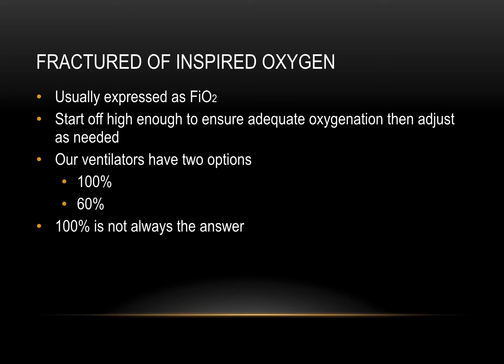So with such limited amounts of what we can vary the FiO2 at, we're going to choose the lowest, safest option for the patient to keep them oxygenated. Just so you know, though, ventilators, when we go into transfers, ICUs, skilled nursing facilities, ventilator care adult homes, they're going to be in probably generally much lower FiO2s. We don't have an option to decrease the amount of oxygen we're giving them, so we're going to give the lowest possible oxygen based on their needs.